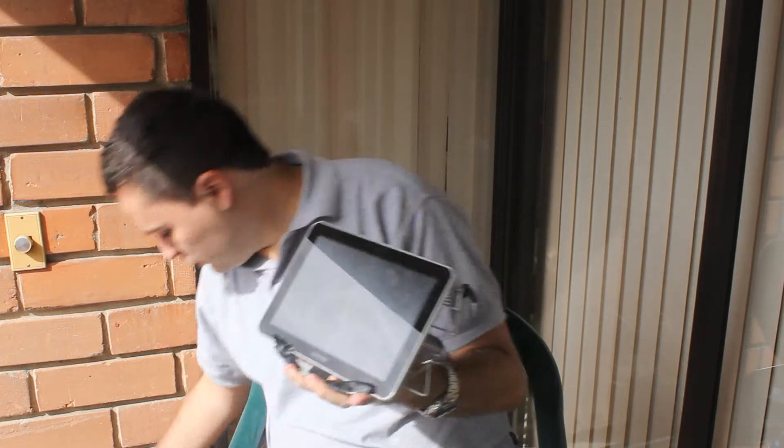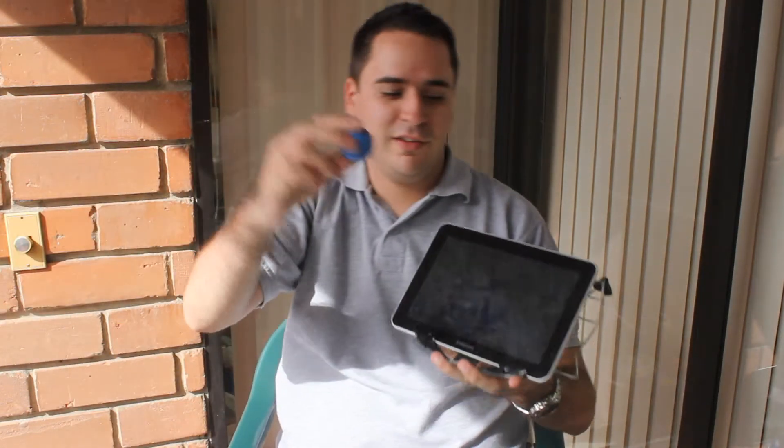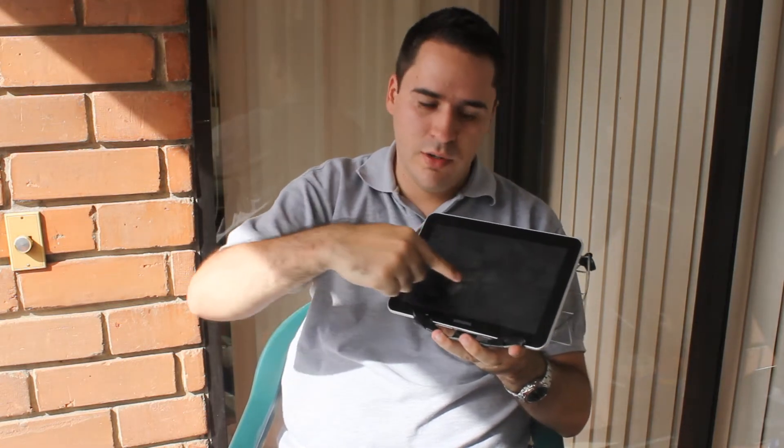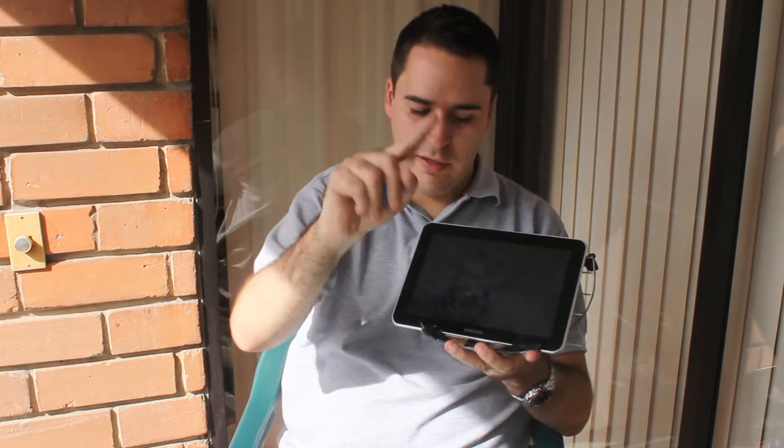But if you don't touch it — if you use something else, for example this plastic pole — you cannot use it. You have to touch, to transmit, to allow the electricity to work from your hand.